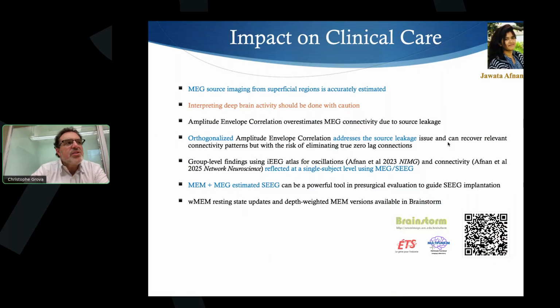No, there was one slide where I was comparing MEM, minimum norm, and beamformer, for instance. In those techniques, it was just pure resting state. It was 60 seconds of pure resting state data. So we selected a clean 60-second segment with no spike, no ictal activity, just eyes closed resting state. That's it. This resting state has some ongoing properties that might already differ in the epileptic brain compared to the healthy brain, and it has been suggested.